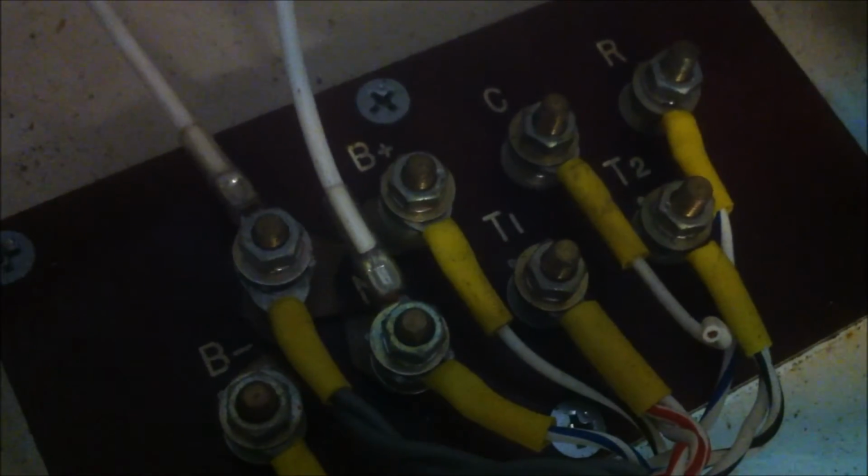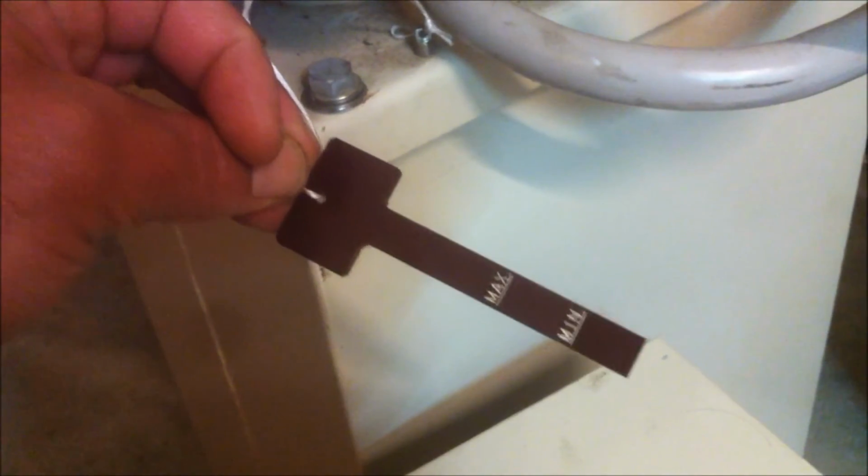And then over here we have the low voltage inputs. So pretty simple to wire up. I've even got a little oil level dipstick attached to the transformer here, so that'll come in handy. Down there is just a whole bunch of 75 kV DC power cable. So it's all that grey stuff just wrapped around my inductor stand there.